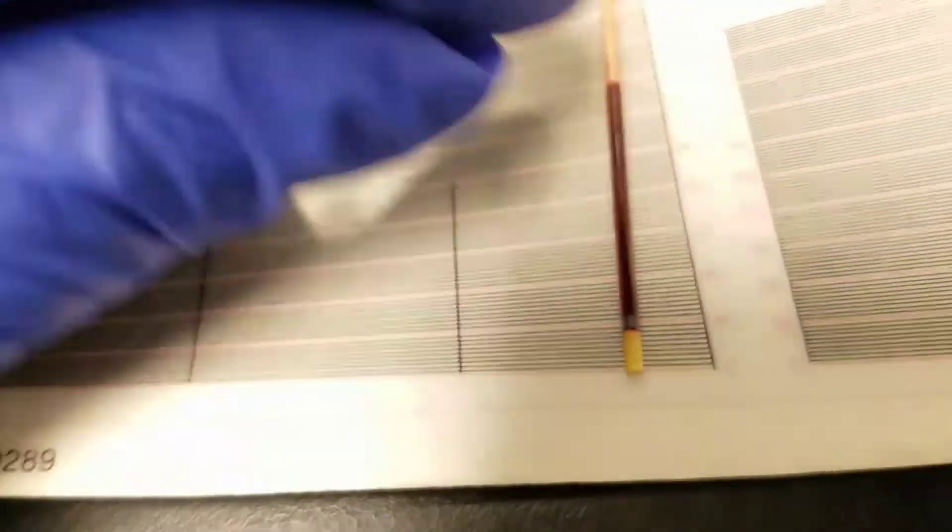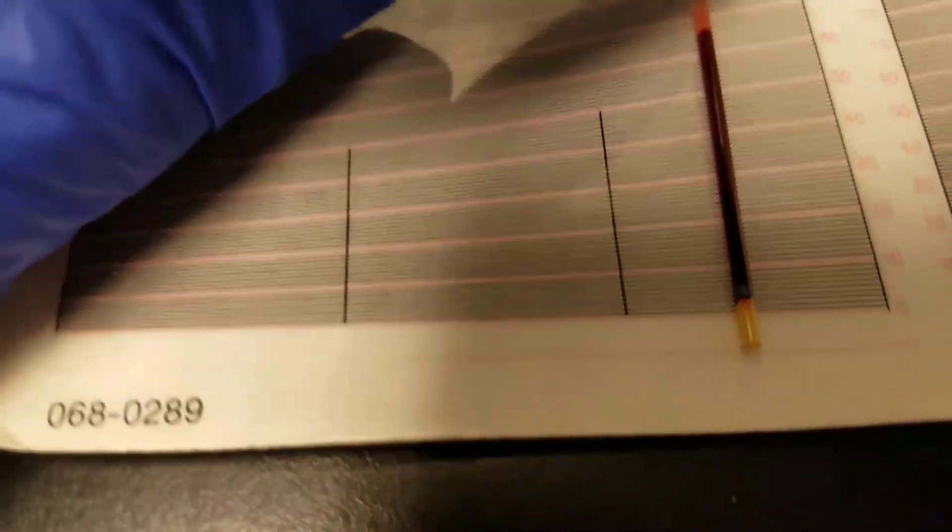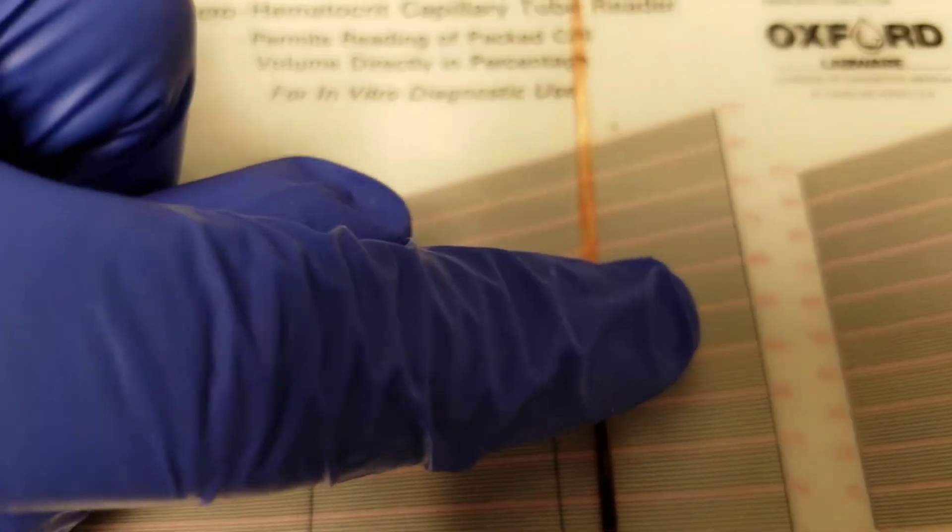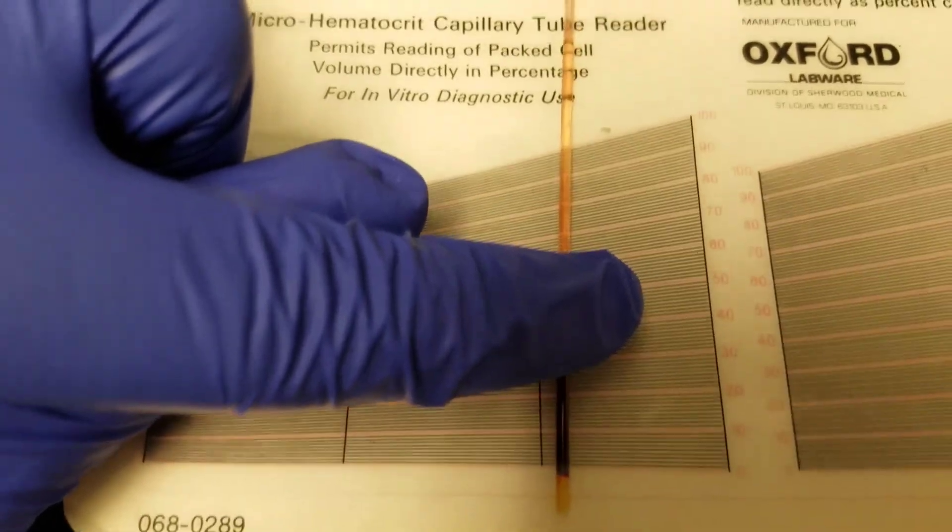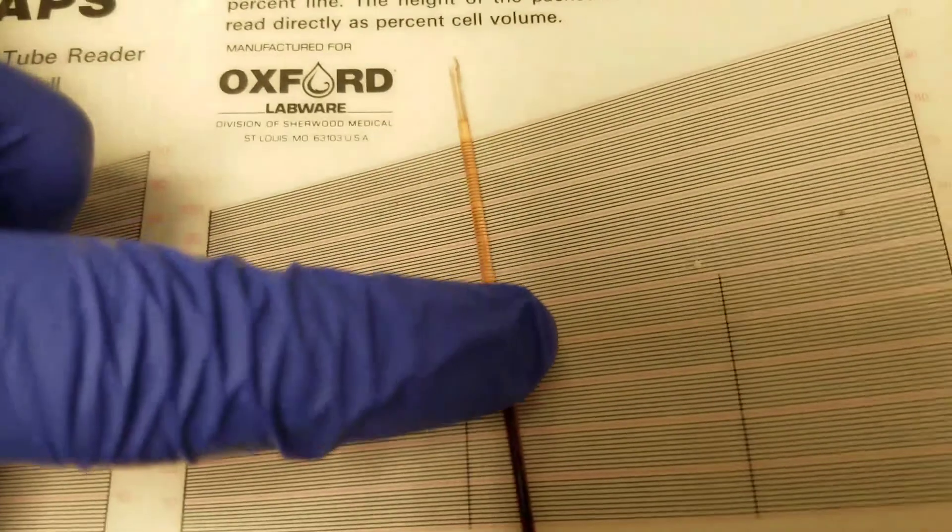Now, if you had less plasma and just less whole blood in there in general, then we could use this smaller incline. But this one's for more tubes that are more full.